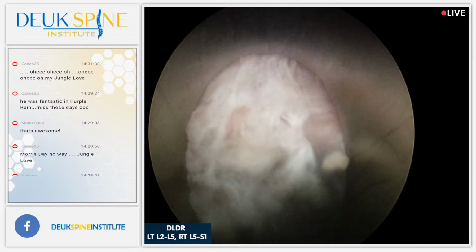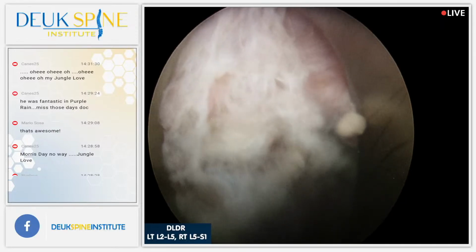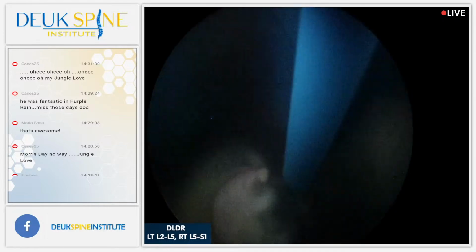Let me see the laser. There's a little bit of herniation just underneath the nerve right here.